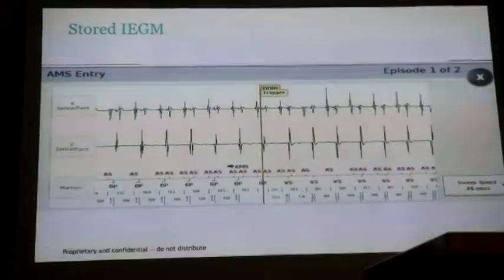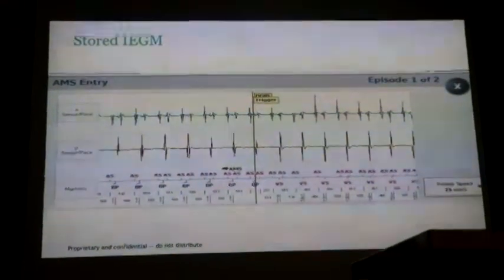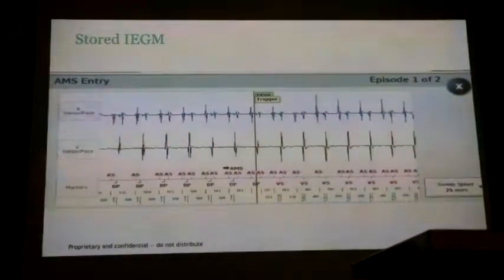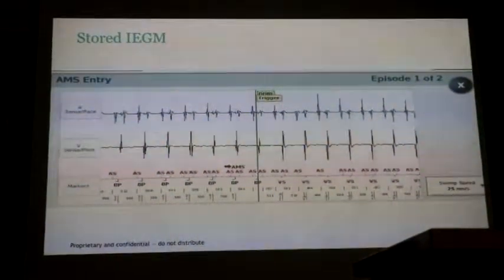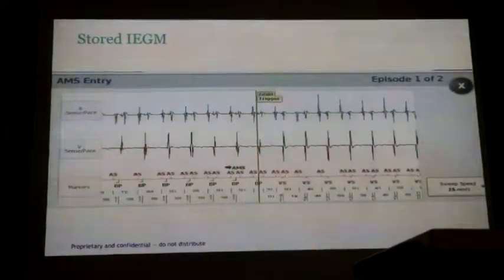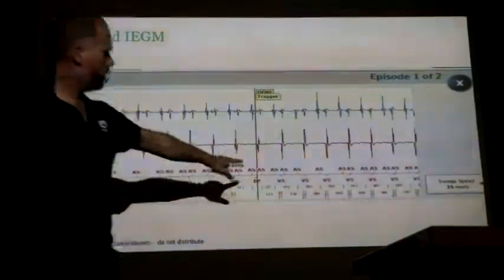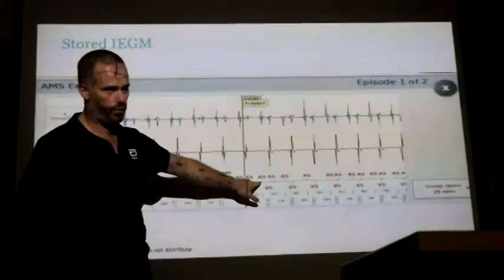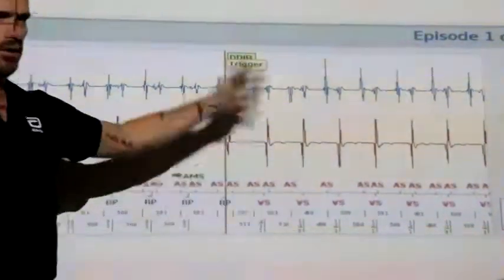The PVAB. So from the R wave to here, we extend that out a little bit. Can we dream of something like a decay delay later on the P wave? There is a decay delay and threshold start on the P wave, but if we wanted to undersense this signal here, we would have to be changing the decay delay threshold start. That's a long way away, like 200 milliseconds away.